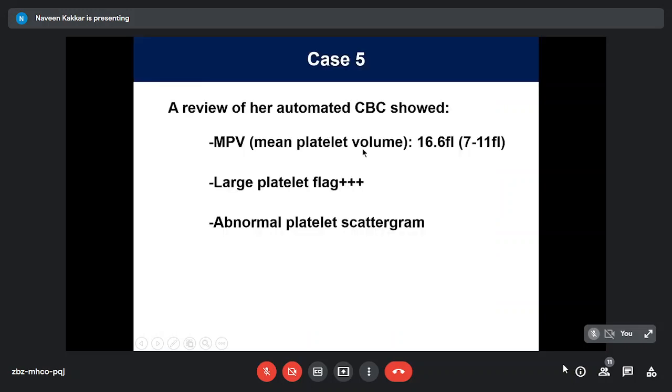A review of our automated CBC on the 5-part analyzer showed an MPV of 16.6. Normal in our lab was 7 to 11. So that was a 5-part analyzer, not the 3-part. It gave a large platelet flag 3+, the maximum. So the machine is indicating to us there are many large platelets, and she had a normal platelet scattergram that we just talked about.